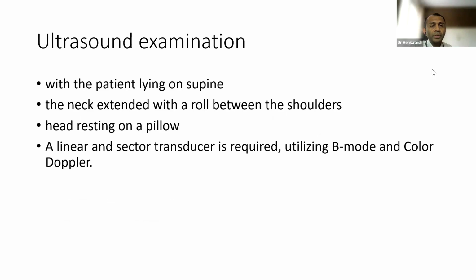Patient will be in supine position, the neck extended with a roll between the shoulders. We have the habit of keeping a firm pillow below the shoulders and placing a soft ring below the head. So the head should be resting on a pillow, then slightly hyperextended.